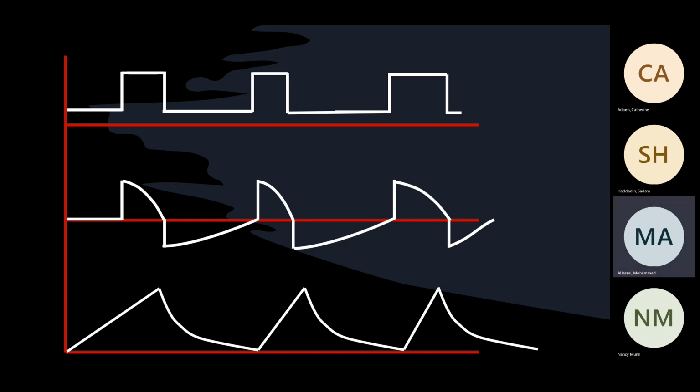Who's starting the breath? It's the machine. How did you know the machine is starting the breath? I don't have any curve at the beginning. Is that right? But there is. Okay, good. So it's the difference in motion, different everything. Pressure and flow here. The timing. That's right.